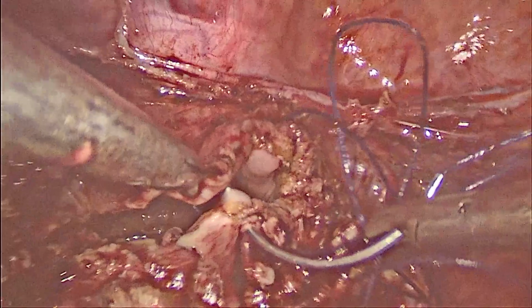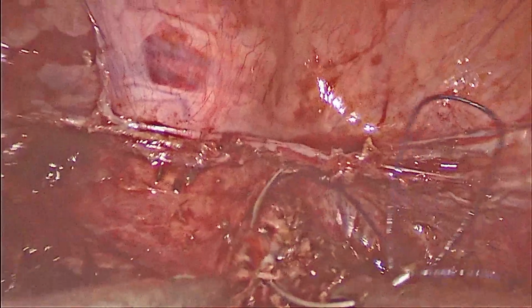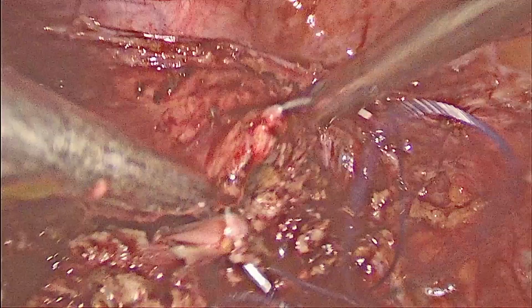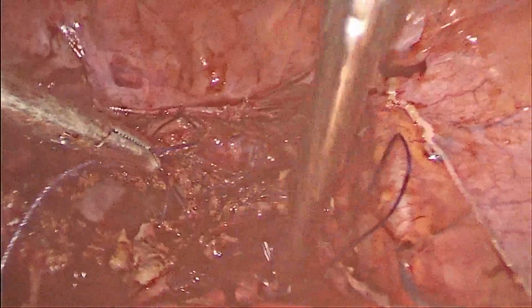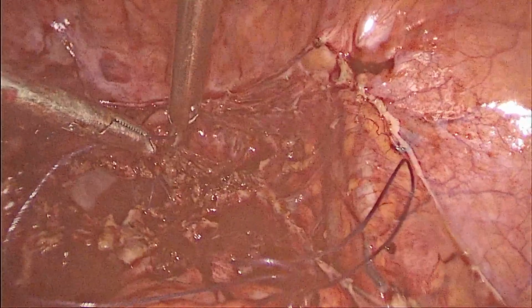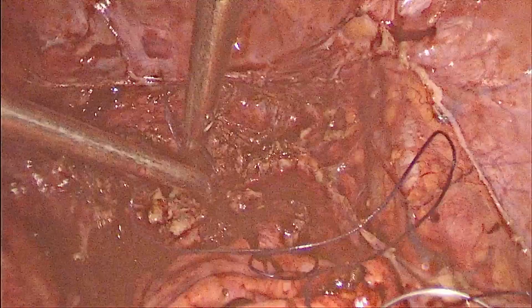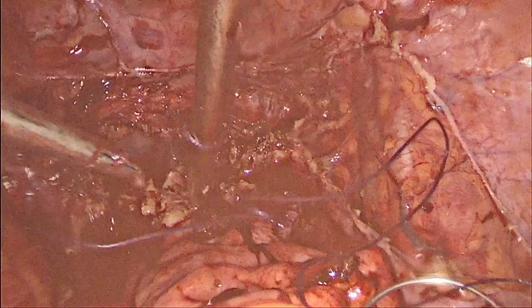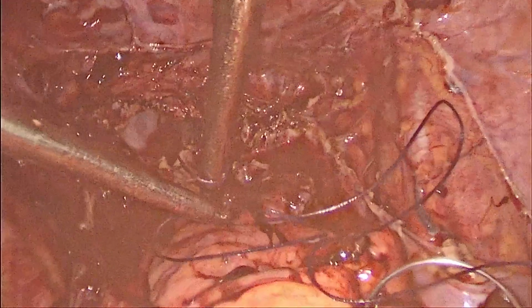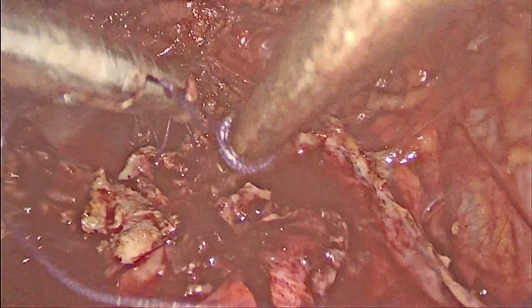So this is a case of total laparoscopic hysterectomy that was performed for a patient with repeated episodes of pelvic inflammatory disease, who then developed a tubo-ovarian mass, which was not relieved by repeatedly taking antibiotics, and who had debilitating dysmenorrhea and menorrhagia. So we performed a laparoscopic hysterectomy.